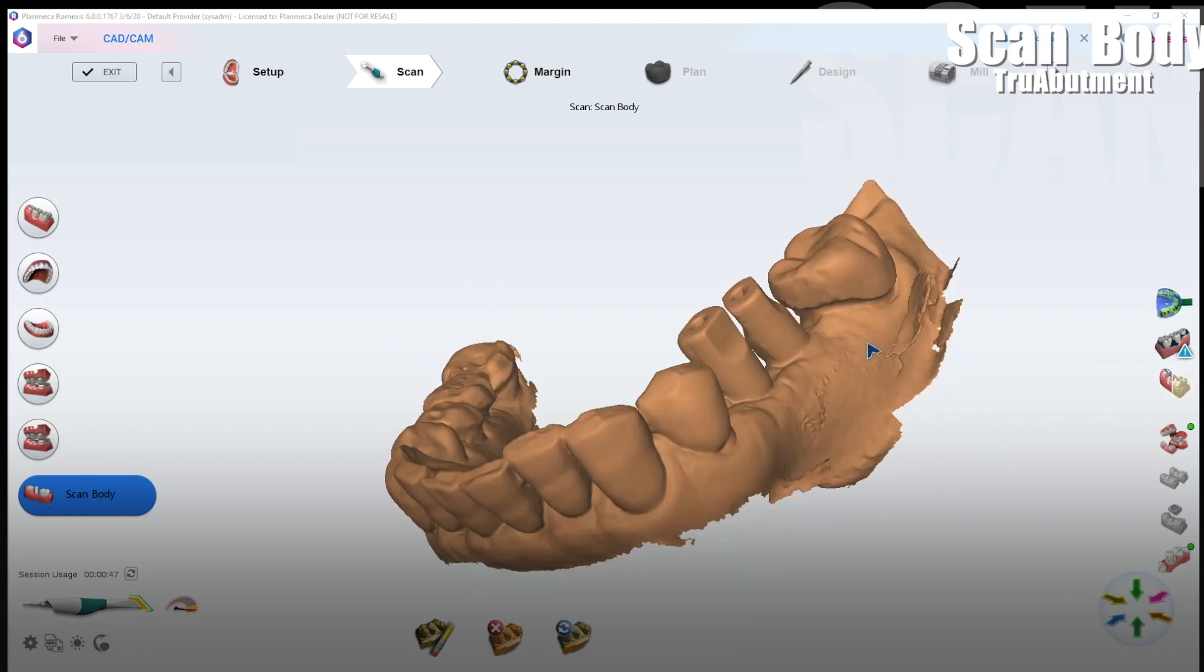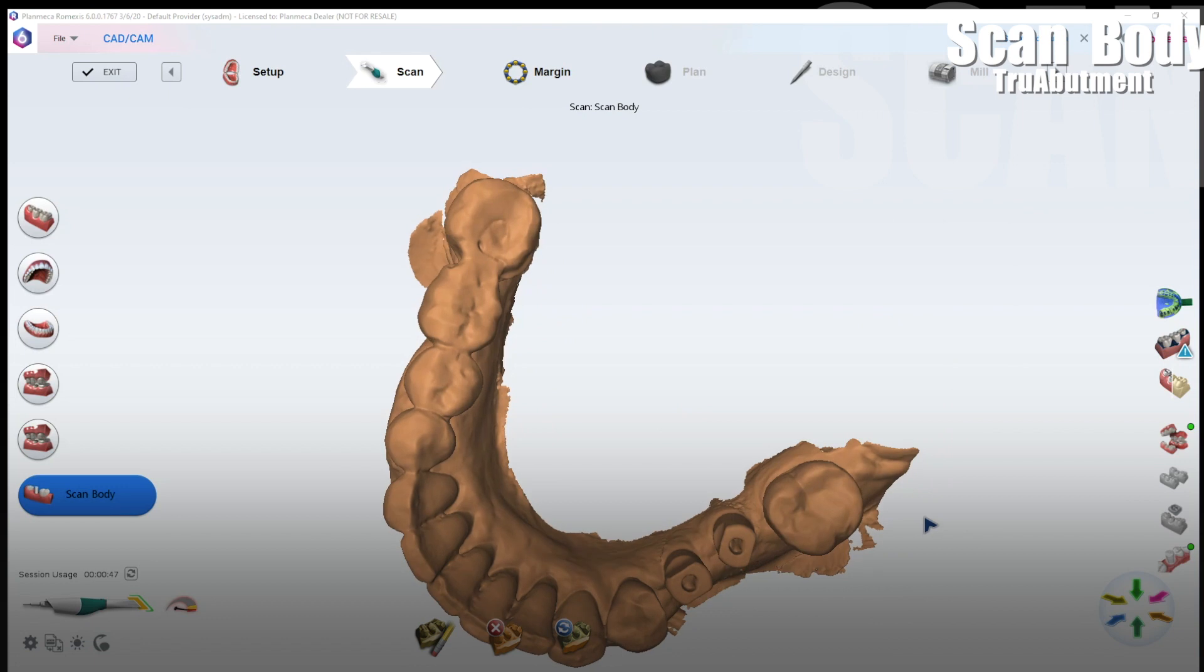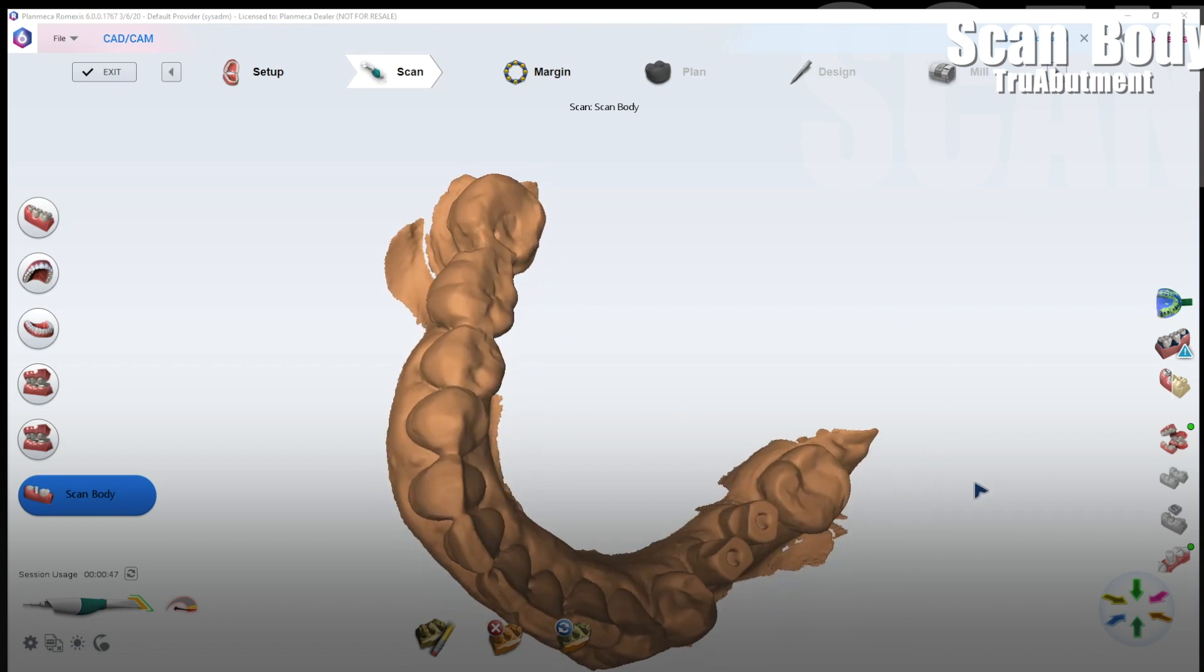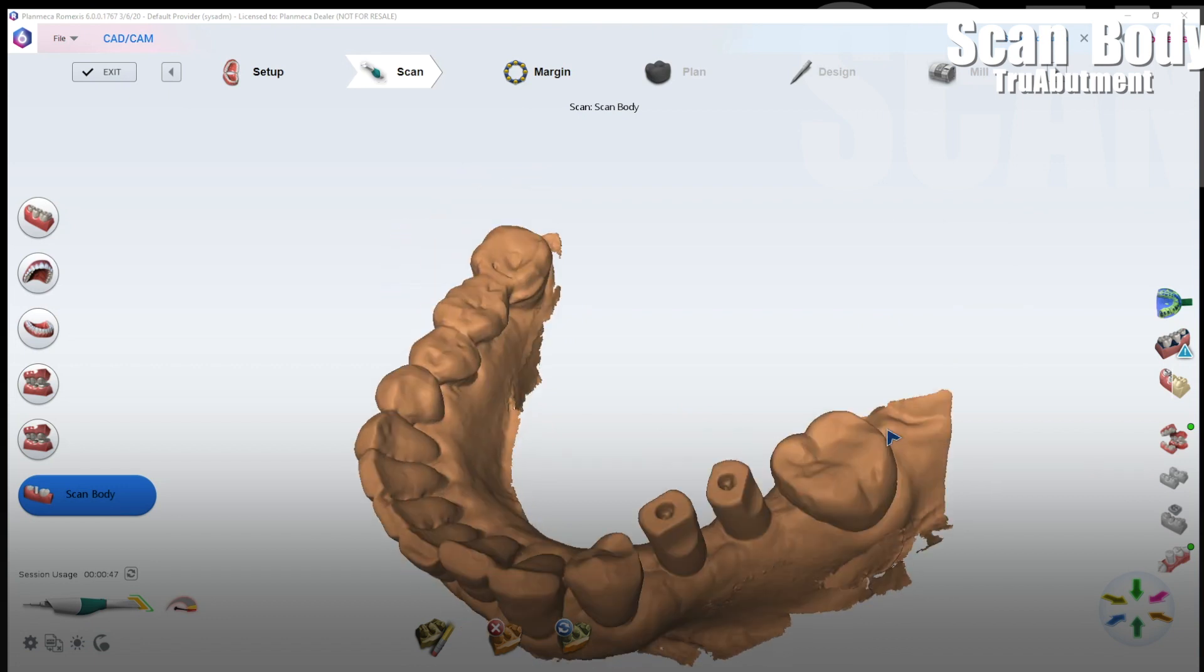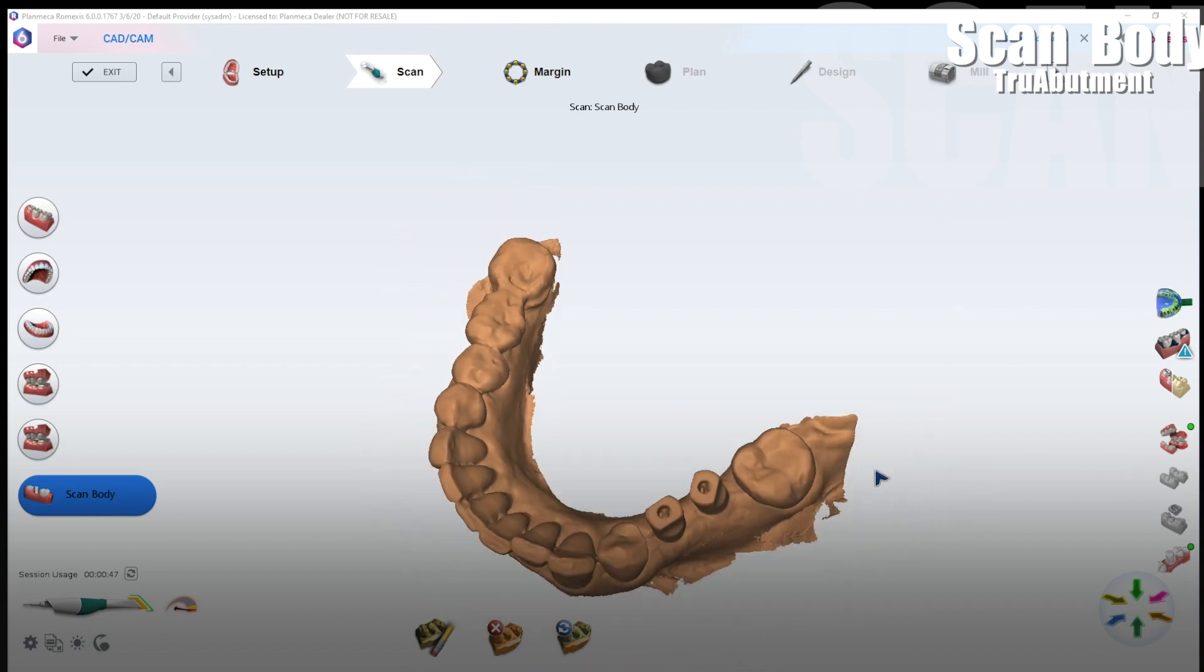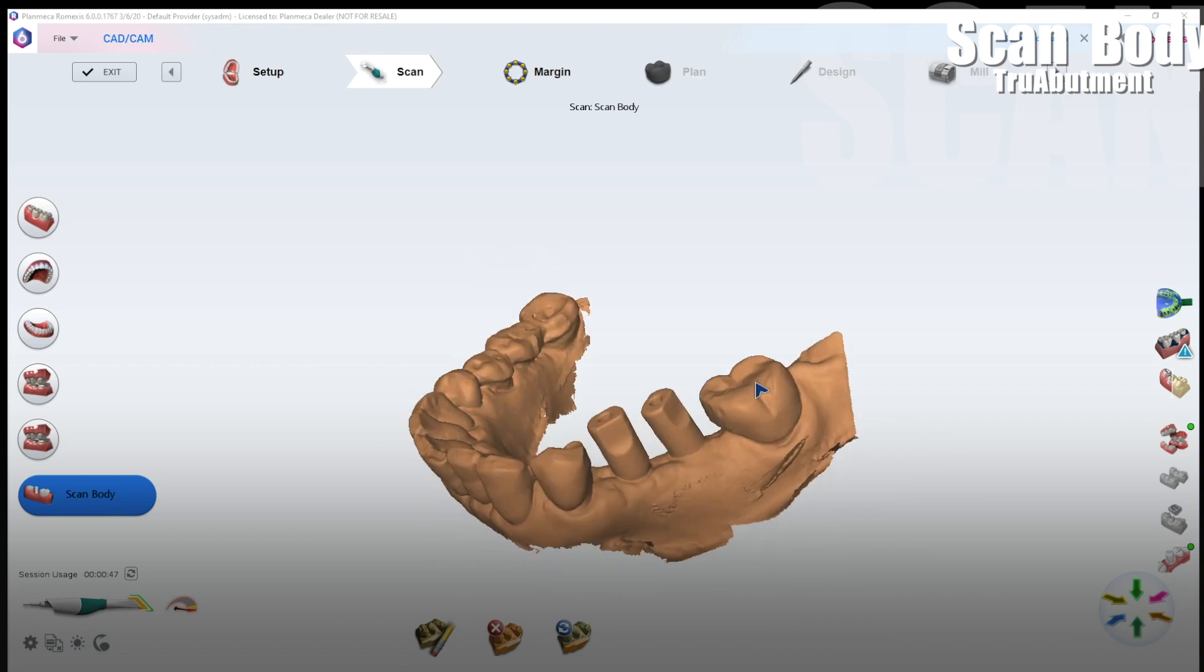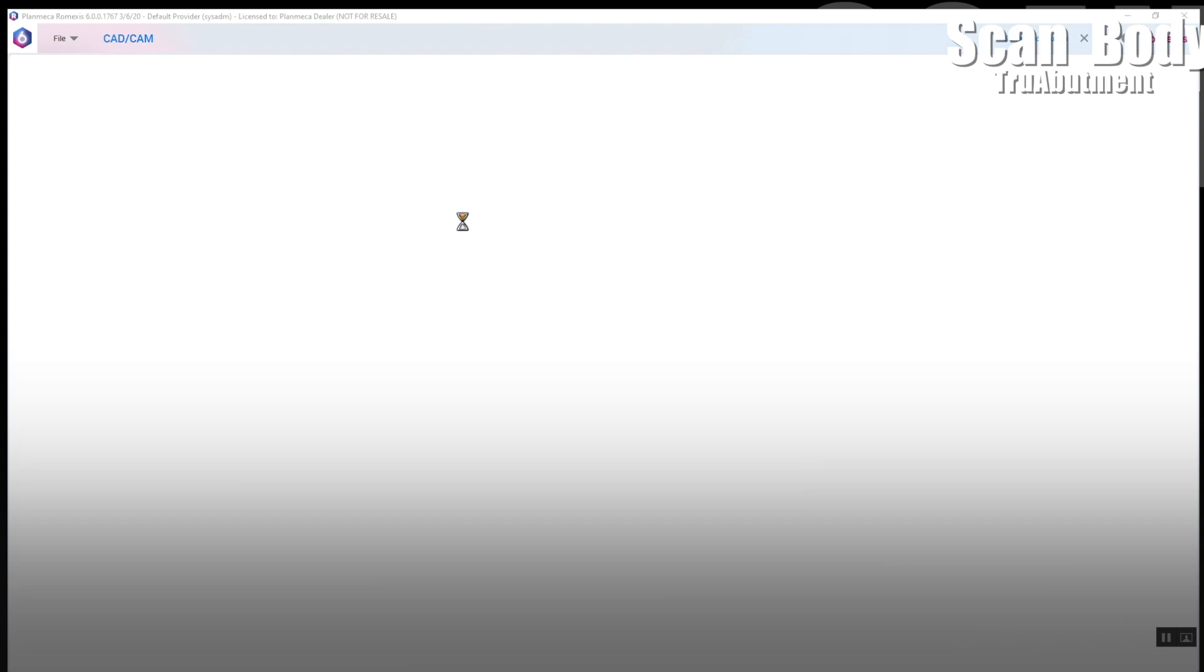So let's take a look at the STL view. You can see we have really good crisp distinct scan body scans. Plenty of data to merge to the laboratory software file of that scan body.